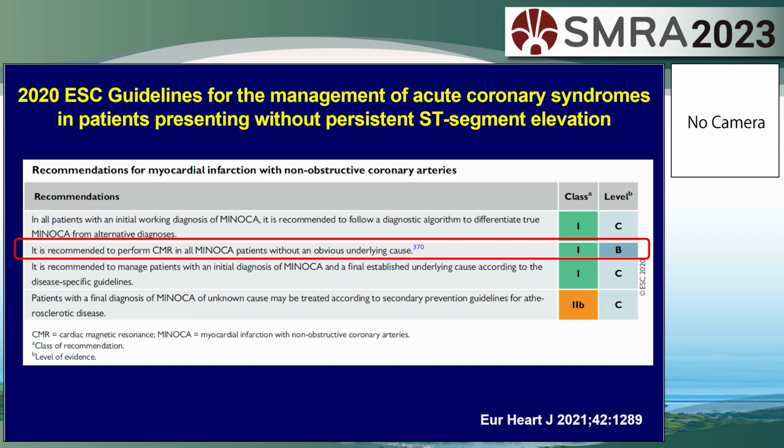On the 2020 ESC guidelines for the management of acute coronary syndromes, it is recommended to perform CMR in all MINOCA patients without an obvious underlying cause. So the recommendation of the CMR, including T2 mapping, is very strong.